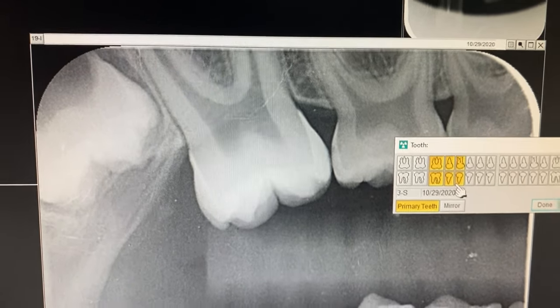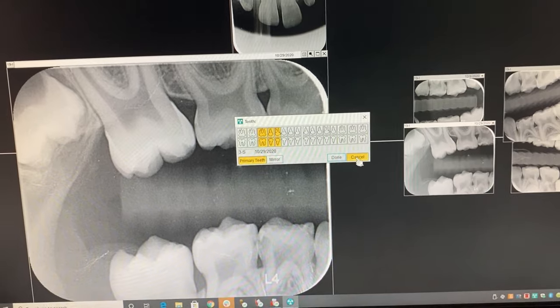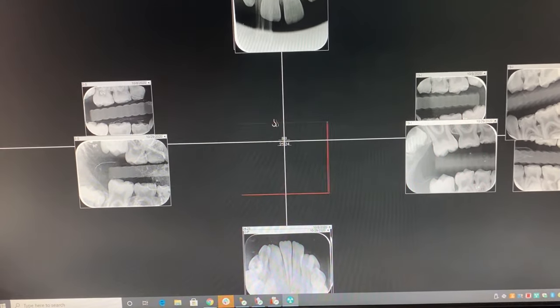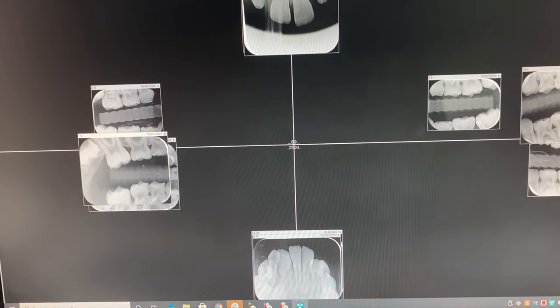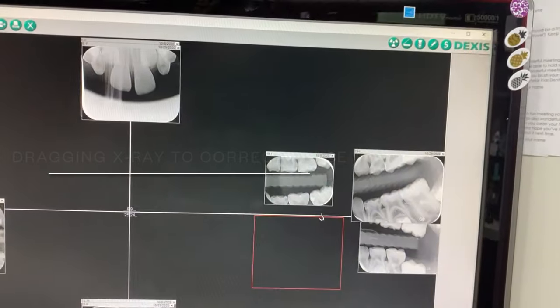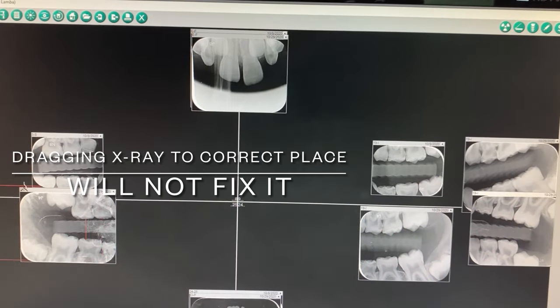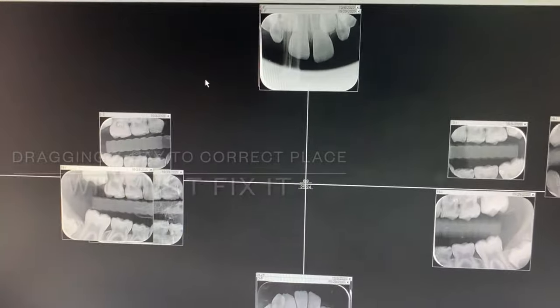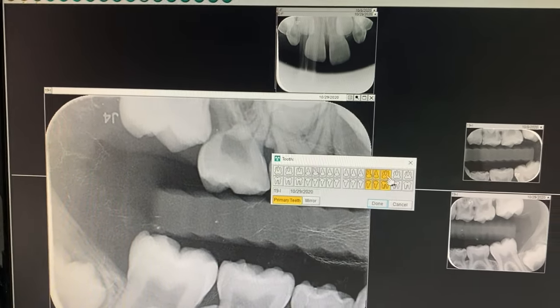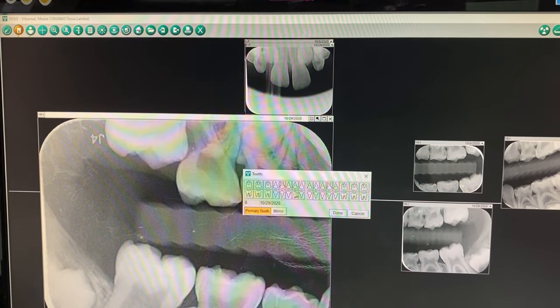This is what you should do, but I'm going to show you the most common error I see. A lot of assistants will say 'it looks like it's on the wrong side, let me just drag it over and rotate it — problem solved.' But the problem is it still thinks it's a left bitewing, so you have to go through the proper steps to correct it.